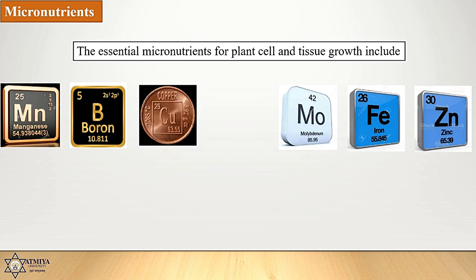Iron citrate and tartrate may be used in culture media, but these compounds are difficult to dissolve and frequently precipitate after media is prepared. Murashige and Skoog used an ethylene diamine tetraacetic acid, EDTA, iron chelate to bypass this problem. Cobalt and iodine may also be added to certain media, but strict cell growth requirements for these elements have not been established. Sodium, Na, and chlorine, Cl, are also used in some media but are not essential for cell growth.